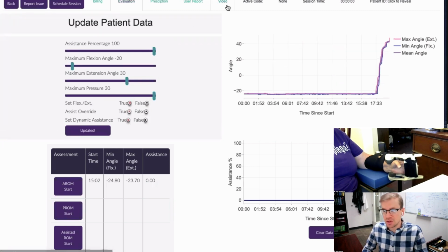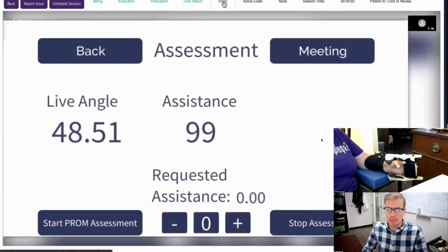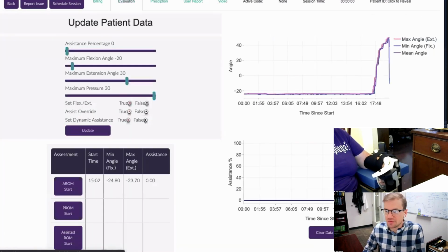I will say this though, really good movement in terms of the actual capacity. So that's really good. I have worked so hard for almost 5 years to preserve range of motion. Yep, and it is quite evident. So what I'd like you to do now, Polly, is go ahead and flex down as far as you can for me. Great. Very good. So nice movement and deflection, and that's really good.